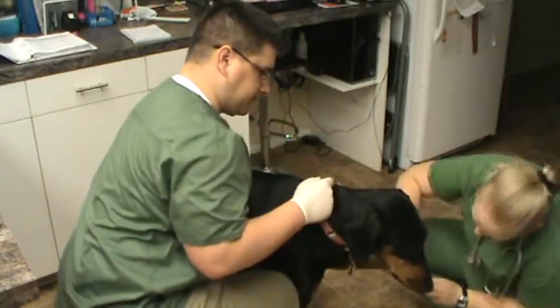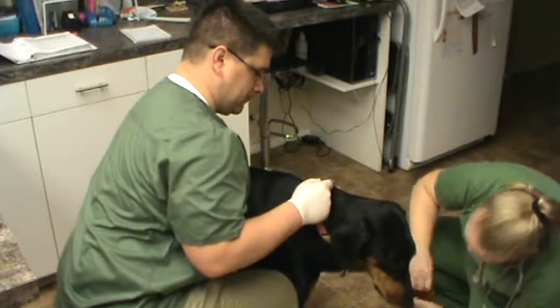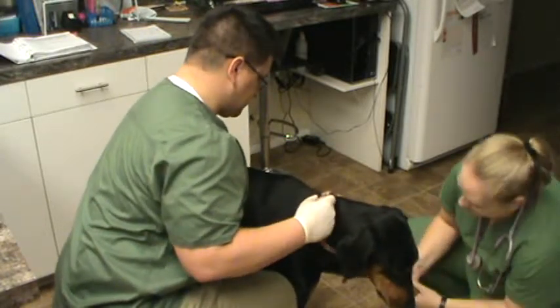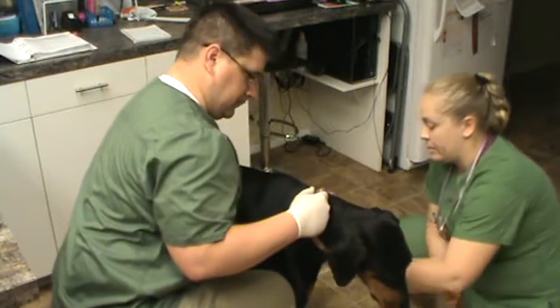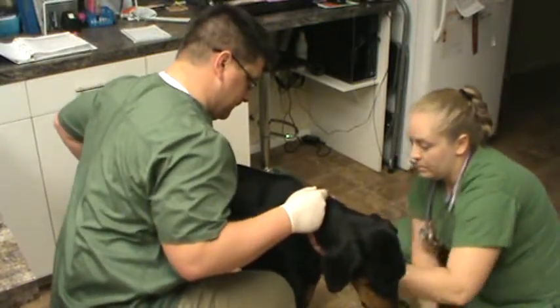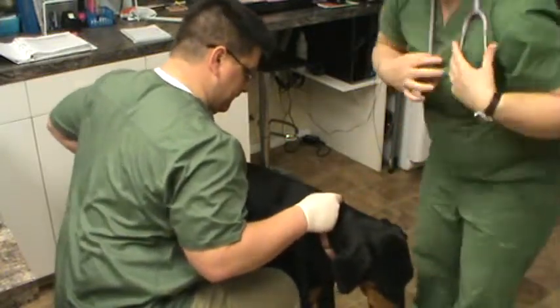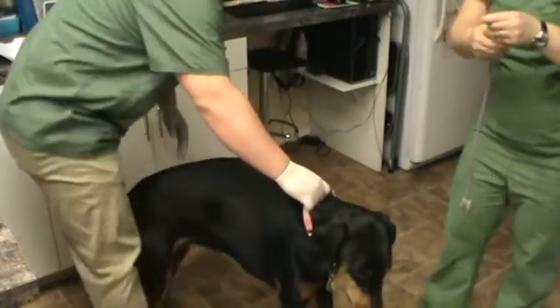Toenails look normal. Paw pads look normal as well as carpal pad. And then checking range of motion. Appears normal, as shoulders appear normal as well. I'm going to go ahead and listen to the lungs.